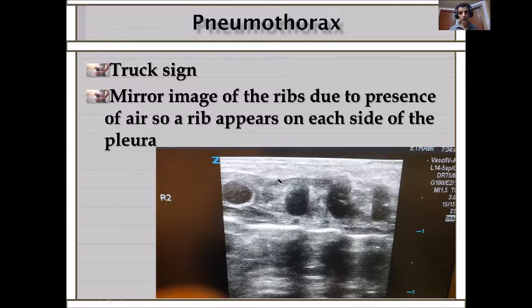The superficial is high frequency. The curvilinear is the lower frequency. The curvilinear is for deeper structure. And how you differentiate is the shape of the picture. Does that answer your question? Yes.